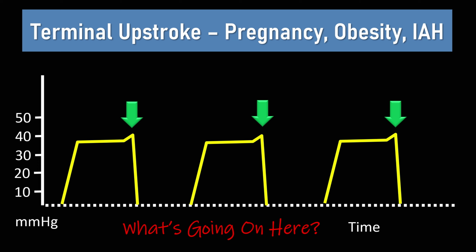It can happen in patients who are morbidly obese, and of course it can happen when there is a pregnant uterus near term. When the mother tries to breathe, there's a little bit of a squish down to push down a little bit of gas at the end of exhalation. Not a lot to do. This is a normal waveform in these patients, and it's perfectly fine.